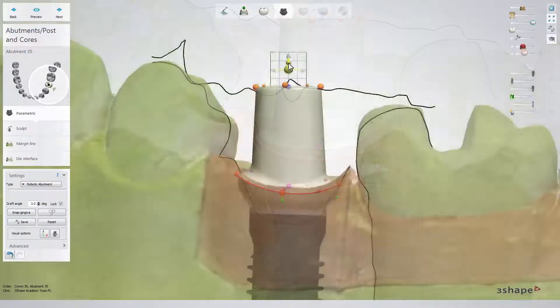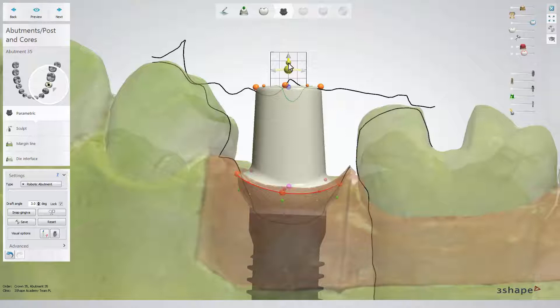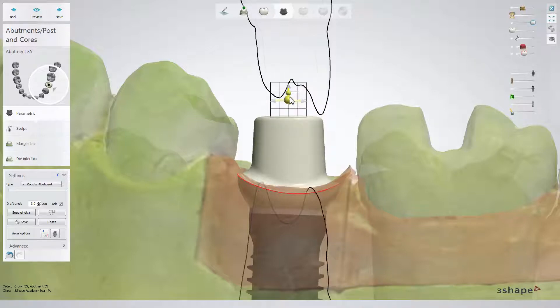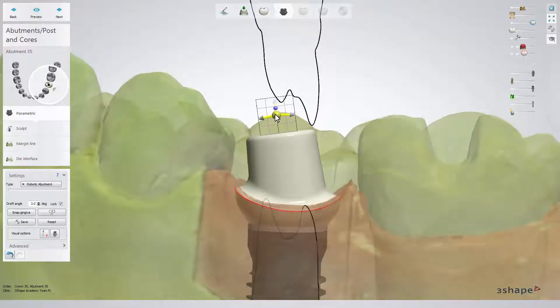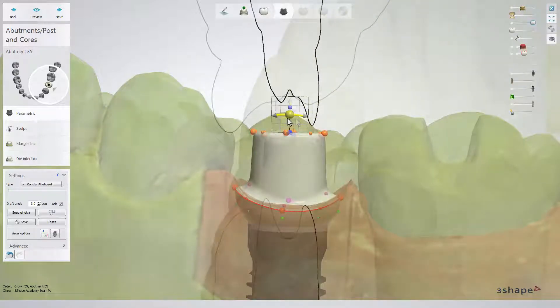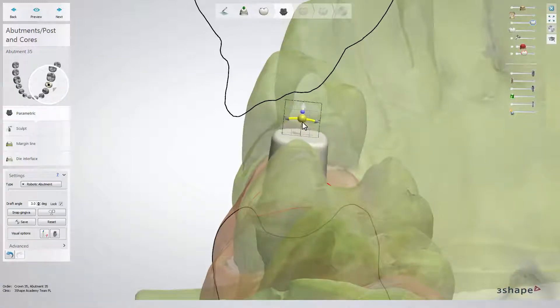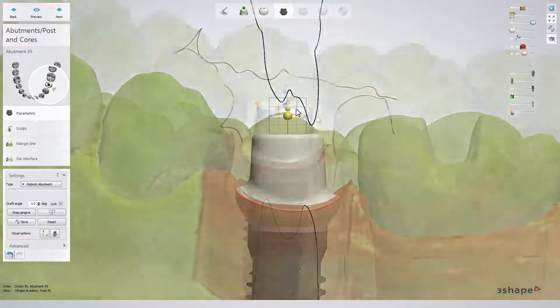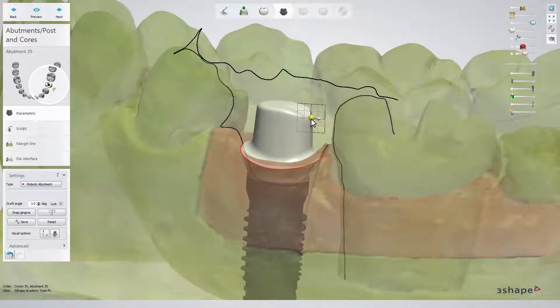When the emergence profile and the margin line of the abutment are set, go to the top cap of the abutment. By using blue spheres, you can adjust the height and angulation of the abutment according to the arrows. The abutment will turn red when going too low or too thin during the abutment design.